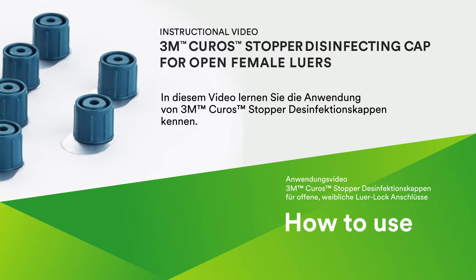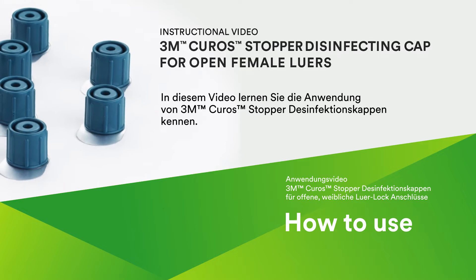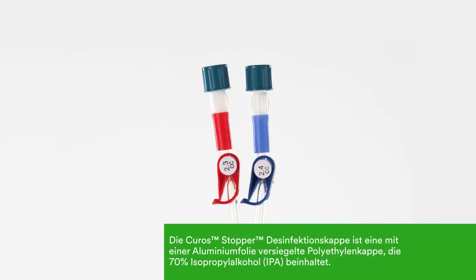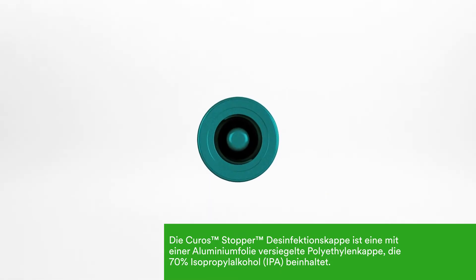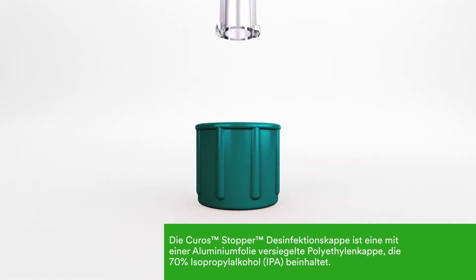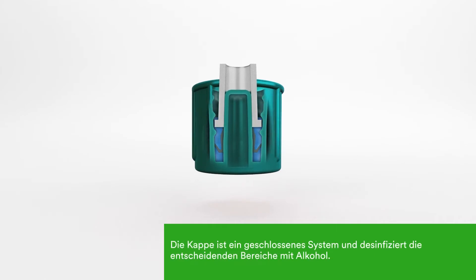In this video, you will learn how to use Kuros Stopper disinfecting caps for open female lures. These caps are designed to fit on a wide range of stopcocks and catheter hubs. Kuros Stopper caps utilize 70% isopropyl alcohol to disinfect critical surfaces of open female lures prior to line access. Their unique design will maintain a closed system and disinfect the critical areas with alcohol.